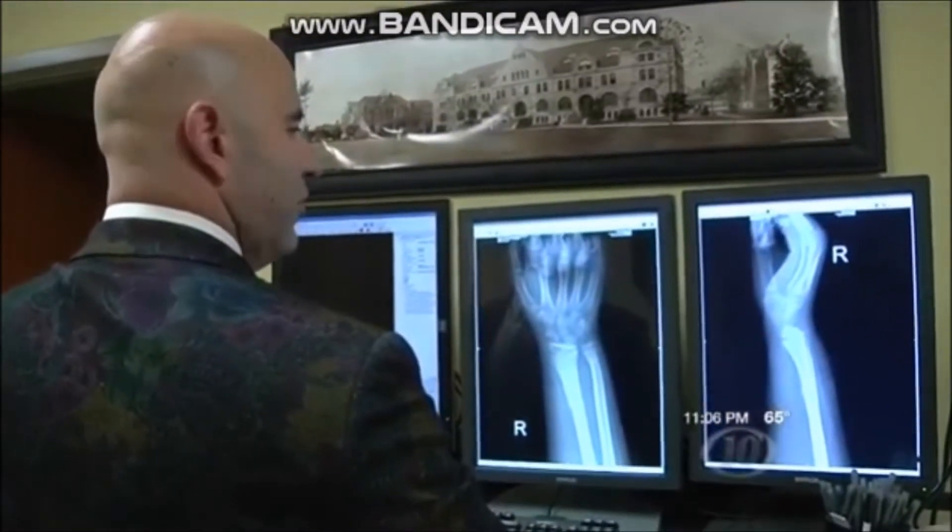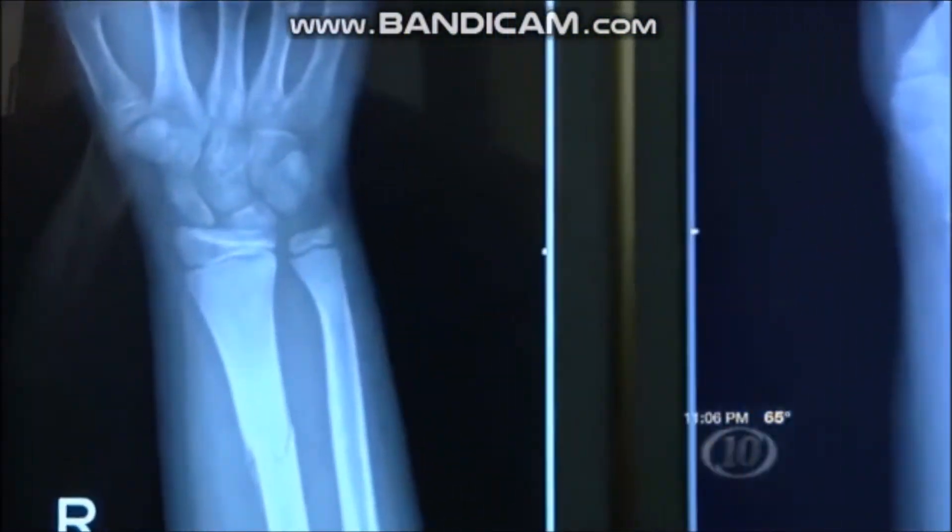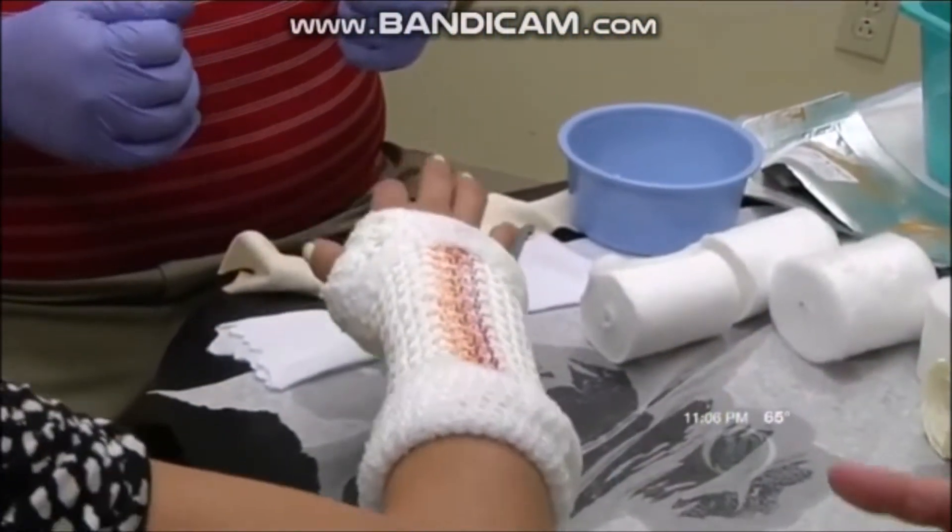Dr. Seth Rosensweig practices orthopedics and sports medicine right here in Acadiana. He started using this lightweight, water-resistant cast on patients about four months ago.